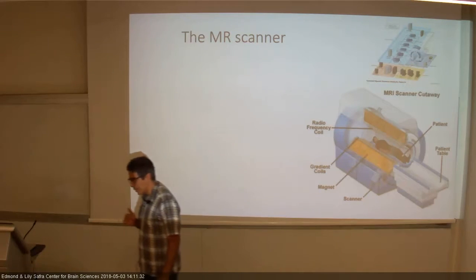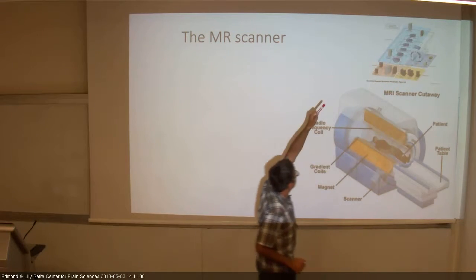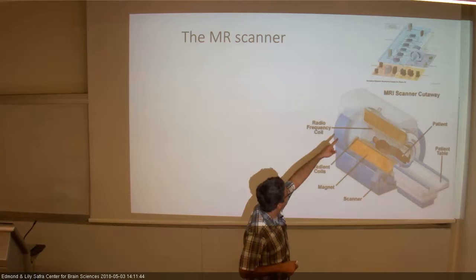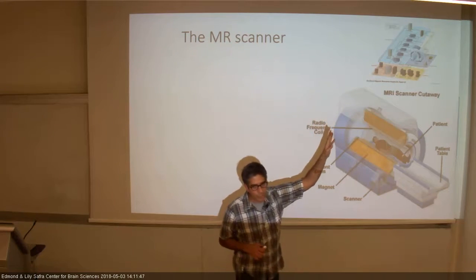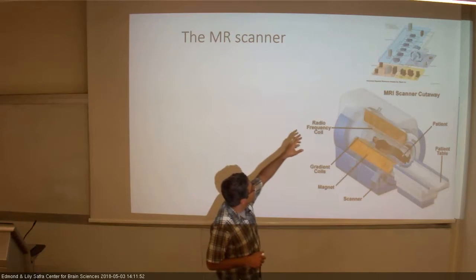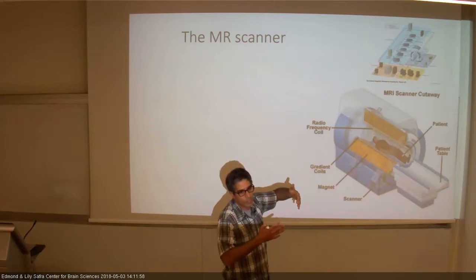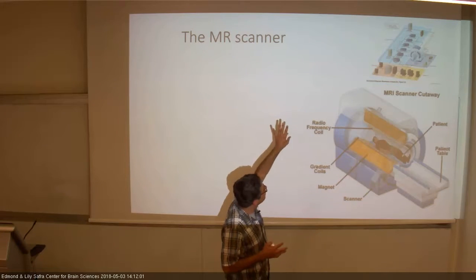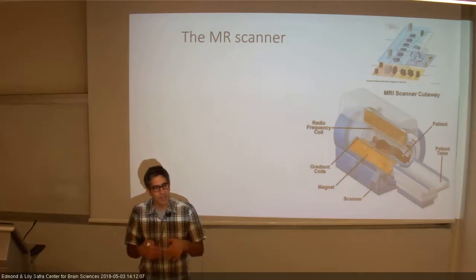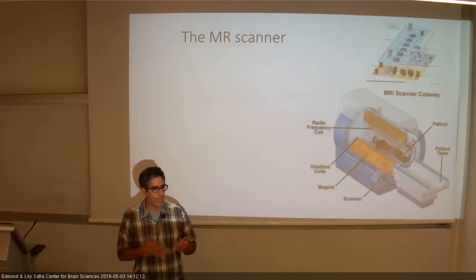What else do we have in the MR scanner? Behind us, there's the control room. So there's the scanner up there. We also have a huge machine room in the back. If you go to the scanner, you hear a very noisy room with many computers and other machines. And there is a control room where the researchers sit and interact with the subject inside the magnet. And there is a full infrastructure also to take the information from the magnet, convert it to images, and essentially aggregate that. It creates a big data set, and there is a full system to handle that.